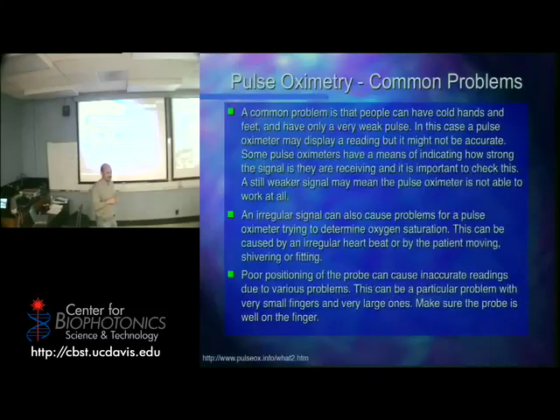So what does the graph on the bottom show? Graph on the bottom is your heartbeat. Okay. But then when I move, it's like. There you go. See, she's proof of what I was just talking about a few moments ago. Now, can you raise up your hand so the rest of your class can see your hand? What might be causing her problems? Show your other fingers. What might be causing problems with her reading? Aha, nail polish. That she's a vampire. Now, why might nail polish cause a problem?